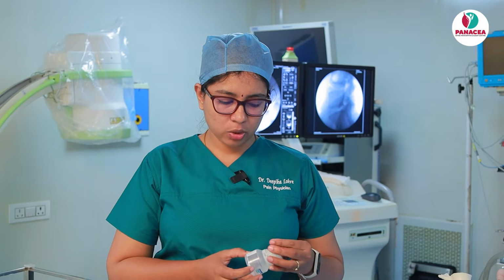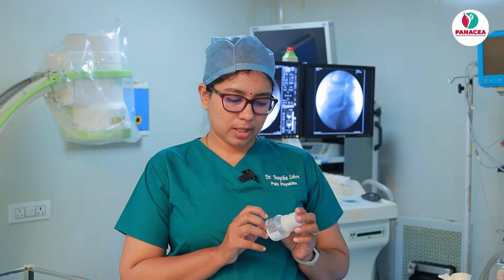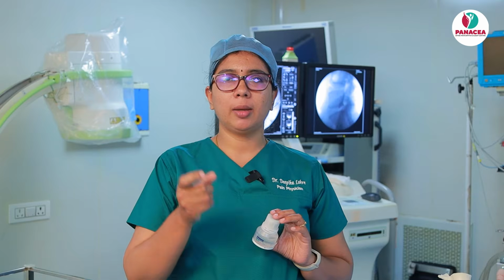Second, what we'll be using is the dye. So there are two types of dyes. One is non-ionic and one is ionic dye. Ionic dye is not used much nowadays. Only non-ionic dye is used, because it has fewer allergic reactions in any patient. So what we are going to use is this iopaque dye, iohexol, and this comes in 350 mg per ml. So we'll use it in the ratio of 30% of the dye and 70% of saline. We'll dilute it and we'll use it.